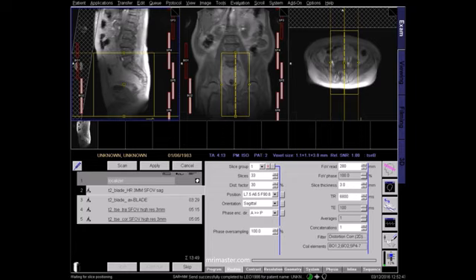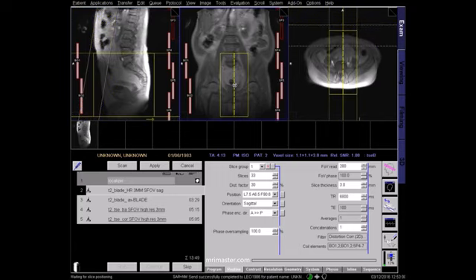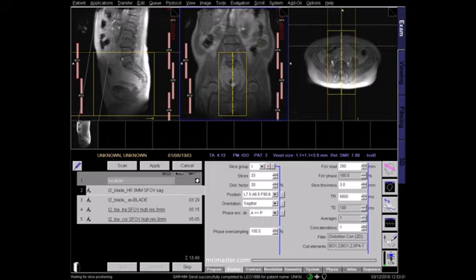Select the appropriate coils and bring the saturation band in over the anterior portion of the abdomen to reduce artifacts from breathing, peristalsis and vascular pulsation. On the coronal localizer, angle the central slice so that it's in line with the midline of the body, passing through the symphysis pubis. On the axial localizer, angle the central slice so that it again passes through the midline and apply.